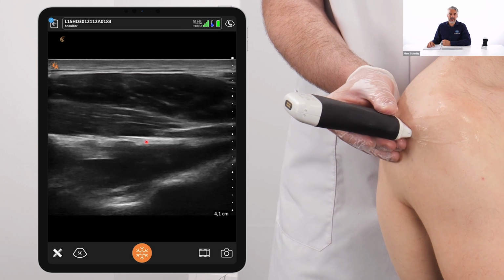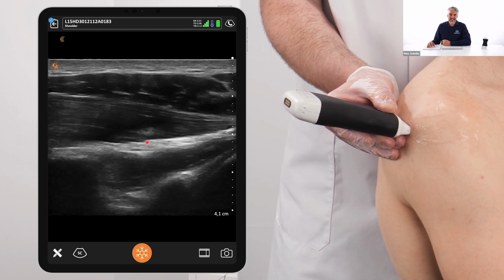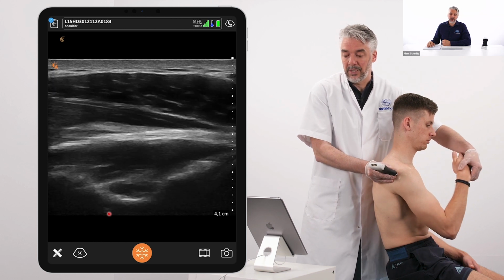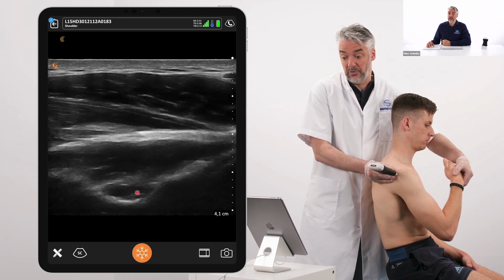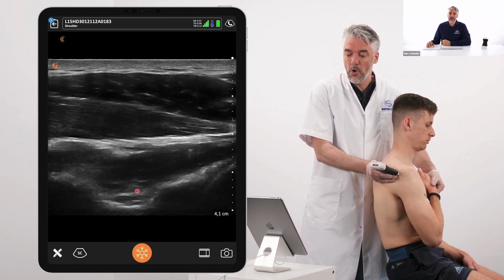So following the glenohumeral joint, a little bit more towards posterior. There we do an internal and external rotation. We can see the spinoglenoid notch with the suprascapular nerve right there. Sometimes you might see effusions or a cyst pressing the nerve, causing entrapment.